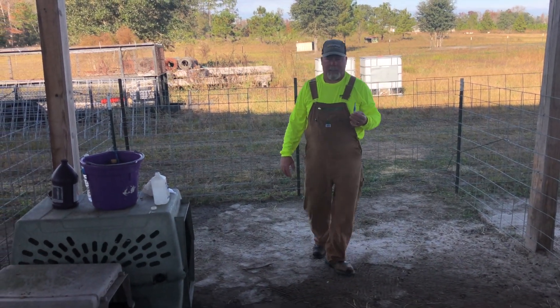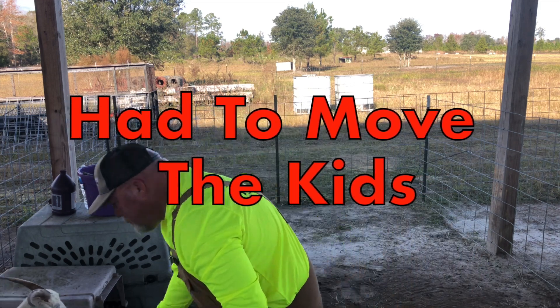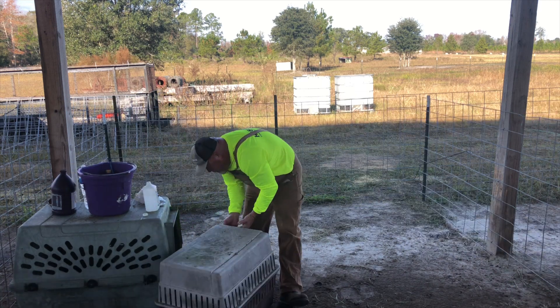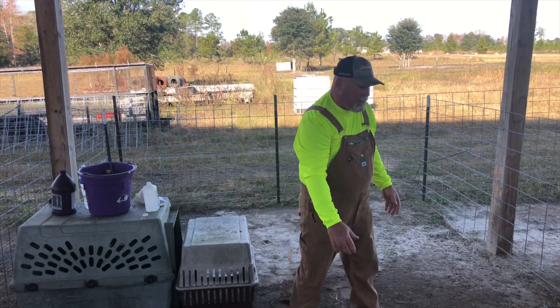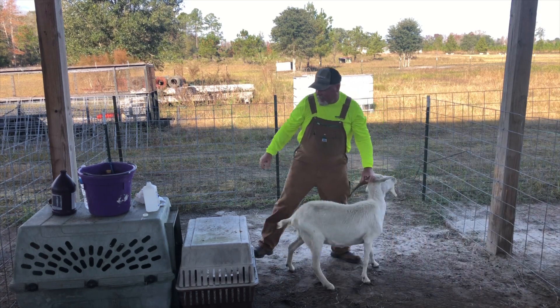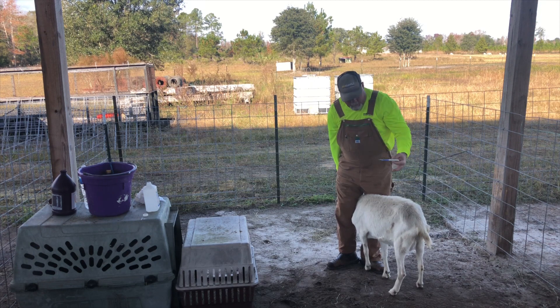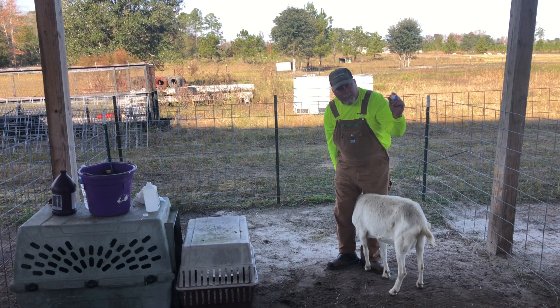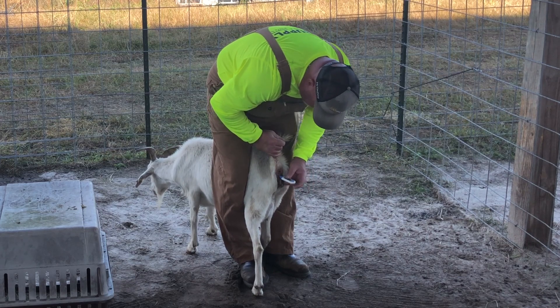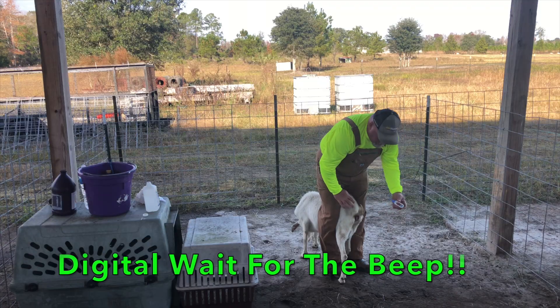You've got to get hold of her and we'll get her checked. Obviously this is a little easier with some help, but I don't have any today. We're going to restrain her as best I can, turn the thermometer on, and insert it into the rectum. Give it time to do its thing. All right — 100.6.